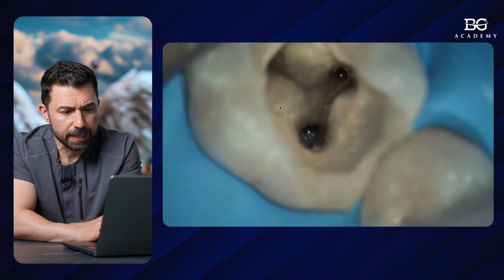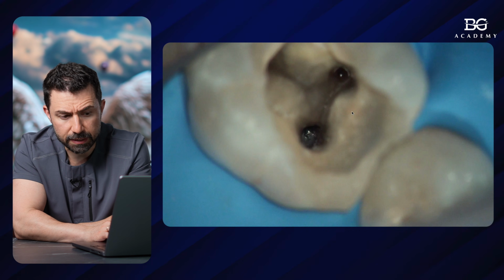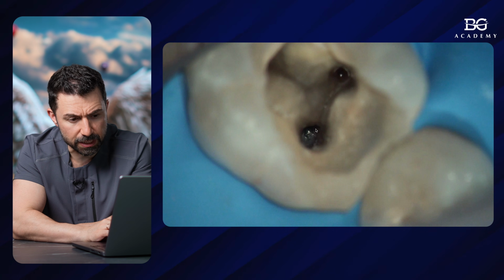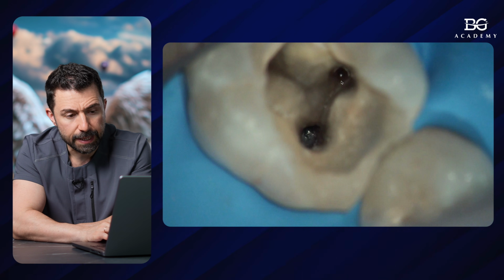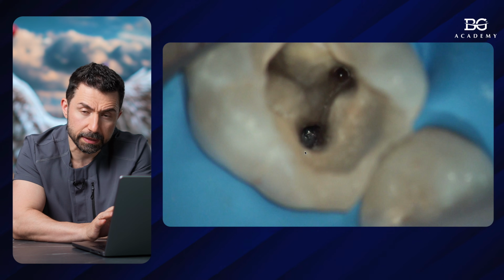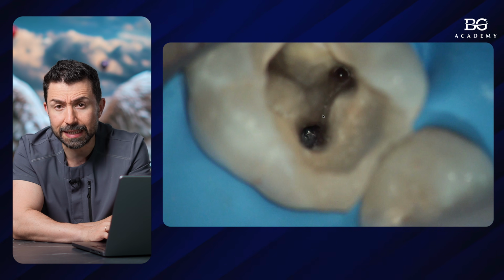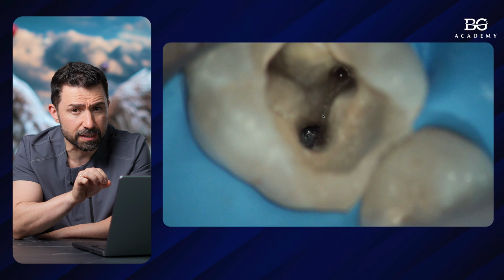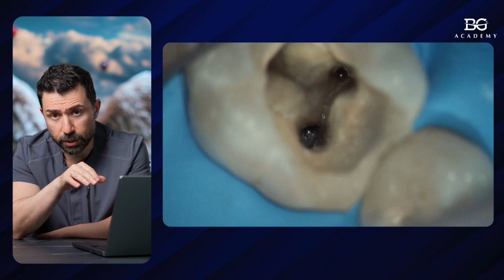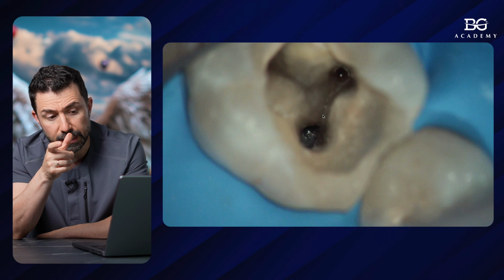So what was done? In this slide you can see a very important element that you have to be very careful with: the isthmus. The isthmus is this line between two root canals, and since these canals are located in one root, what we can do to make the access to the fragment better and to be able to visualize the fragment is start instrumenting the isthmus. We can do this with very thin special endodontic burs. We can do it also with ultrasound. In some cases we can really merge the isthmus in the coronal half of the root canals between these two.